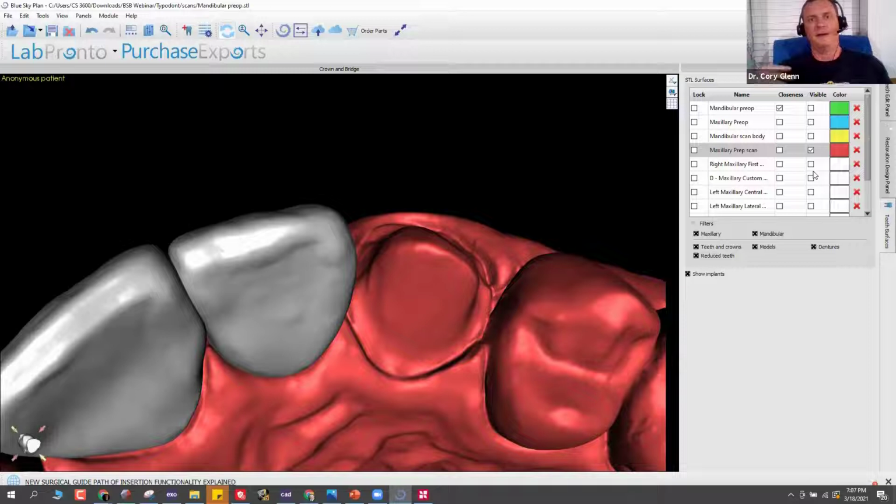So in terms of dental toys, you're talking about a very minimal investment. Where they really shine, I mean, it's a great printer overall and they've got plenty of good stuff, but I love a lot of their materials. They've got super strong stuff. They've got in-house chemists and develop all their own materials. So it's an impressive printer.